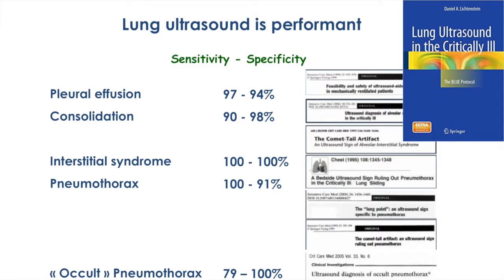In neonates, unfortunately, we do not routinely perform CT scan as such a comparison is impossible. Our only gold standard is a chest X-ray, which is actually a gold standard by default and had never been evaluated in neonates.